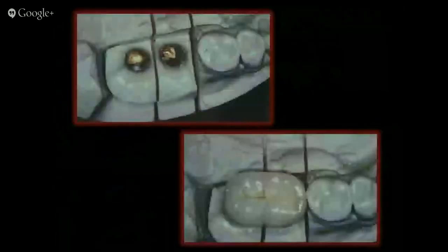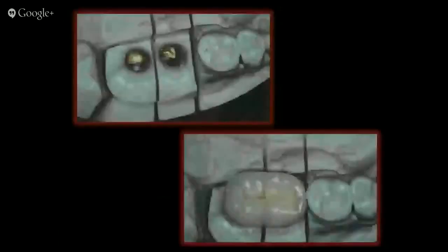Implant crown contours. We all believe that we should try to simulate nature. What exists is what we should replicate and duplicate. Perfect. Makes a lot of sense as far as fixed prostheses go for tooth supported restorations. Now we again have to evaluate.